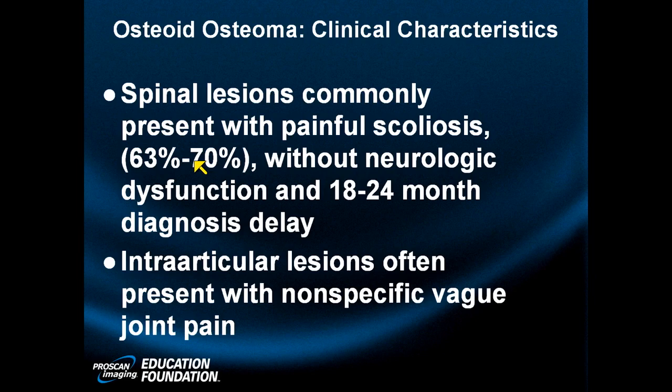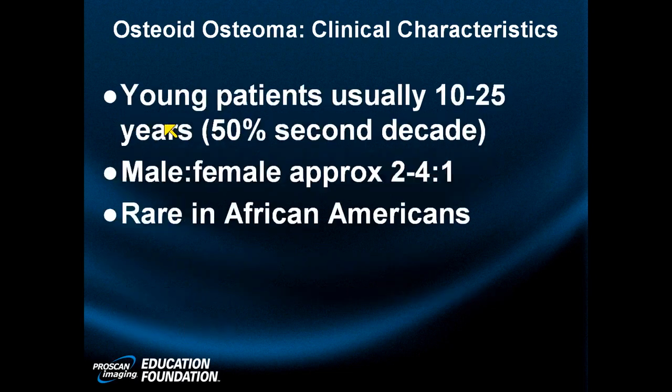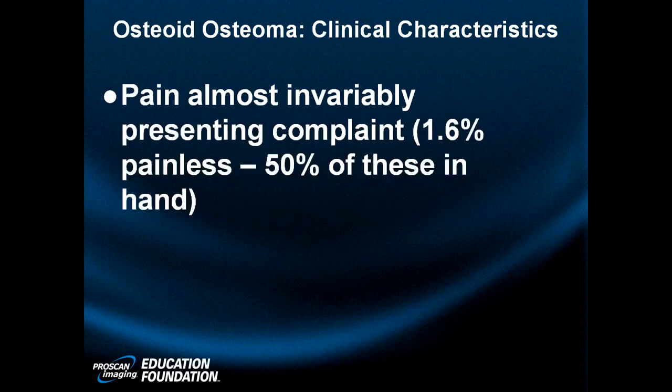That is one of the few times when I will consider doing a CT around the pelvis of a younger man or woman. When I have unexplained hip edema and I'm not sure I can detect the nidus on MRI, I go do very thin section, 0.5 millimeter CT with reconstruction, and I frequently find the nidus. The amount of edema is very variable when you have these subcortical intra-articular osteoid osteomas. It can be pronounced or virtually non-existent. It's a tumor of younger individuals. Males predominate about 3 to 1, and it is rare in Black Americans and African Americans.